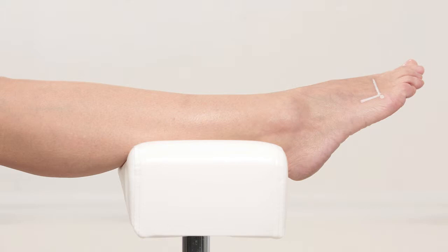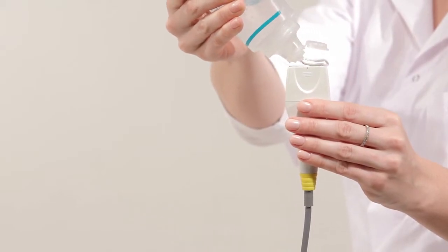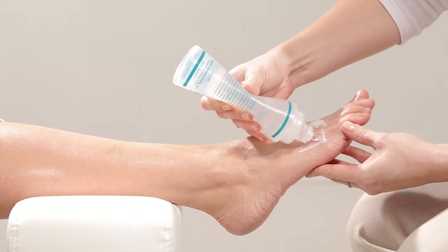Reposition the subject's leg with the Achilles tendon placed on the leg rest. Apply a uniform layer of ultrasound gel on the probe surface and on the measurement surface.